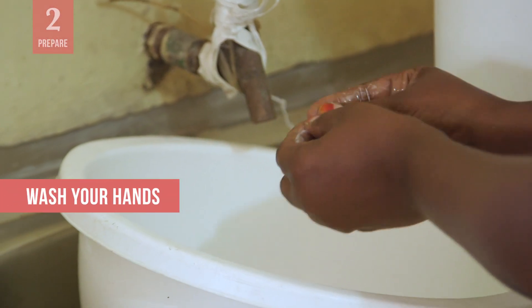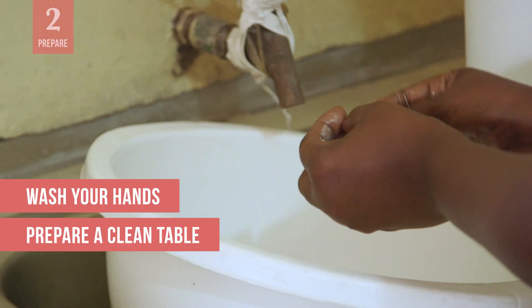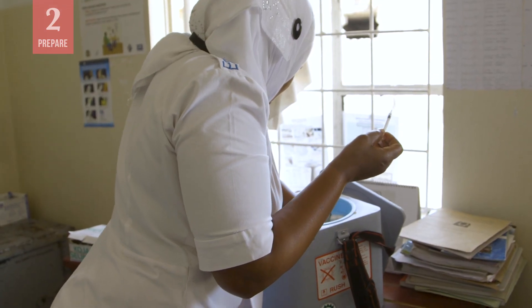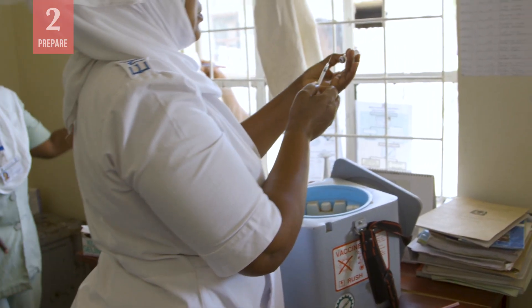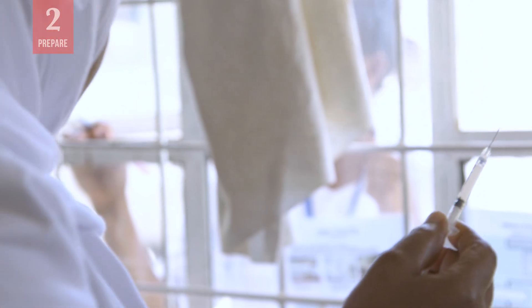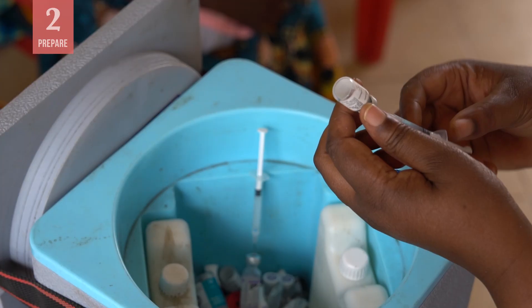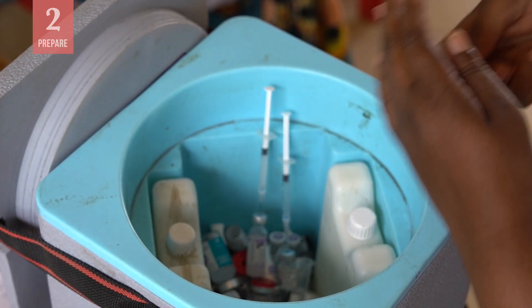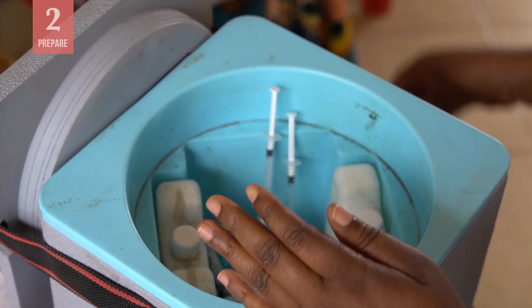Always start by washing your hands and preparing a clean table to work on. Whenever possible, prepare the vaccine away from the child and caregiver, as seeing the materials may make them feel anxious. Once you have prepared the vaccine or vaccines, keep them close at hand in the order you will be administering them.